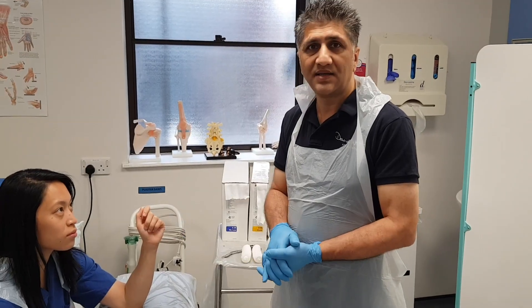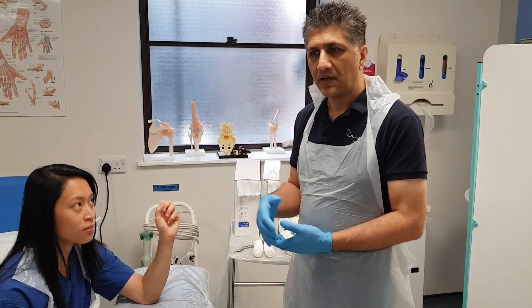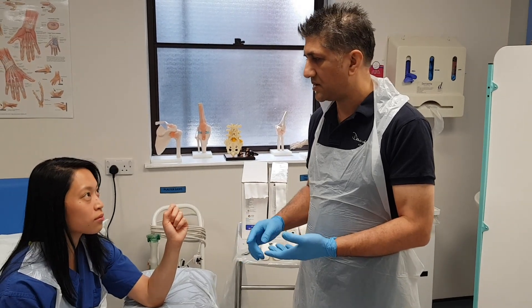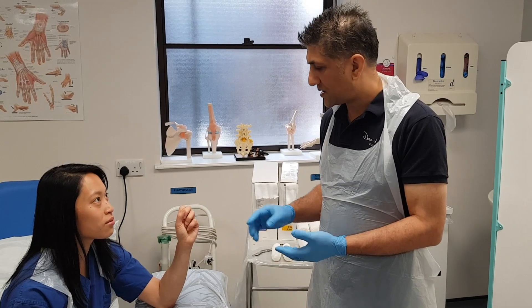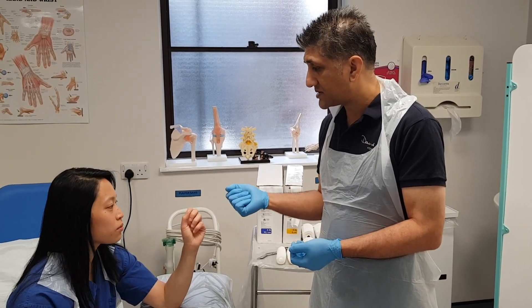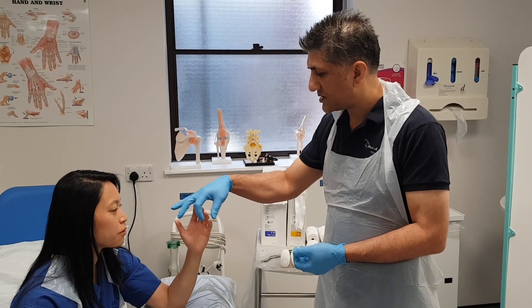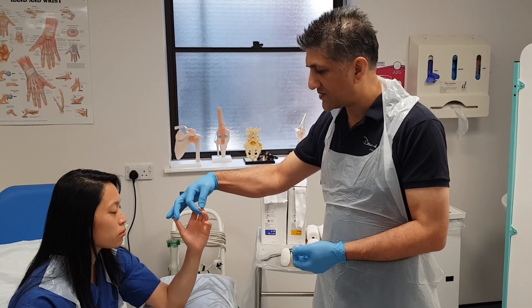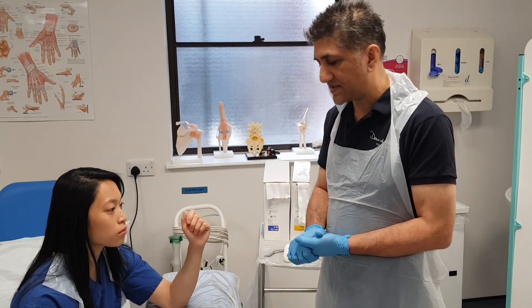Jess has kindly volunteered to allow me to apply a plaster backslab to her arm. As my patient Jess, have you had pain relief? Right, and I'm also going to check: have you got any pins and needles in your hands? And can you feel me touching each of your fingers? I'm going to do the capillary refill test — five seconds — just to make sure that there isn't any neurovascular deficit.